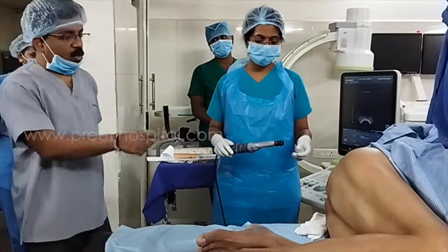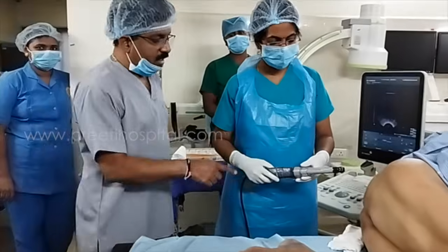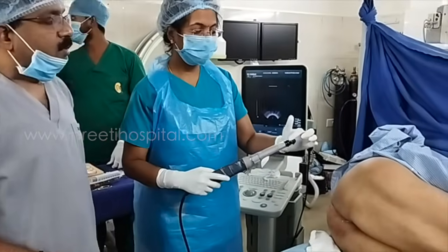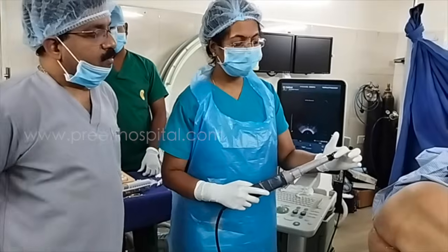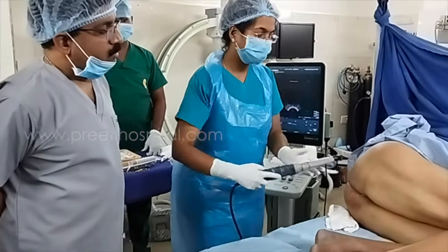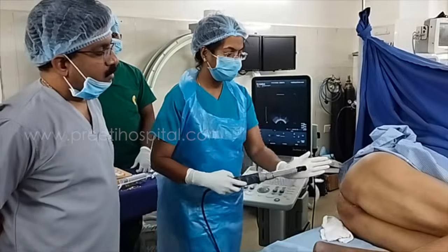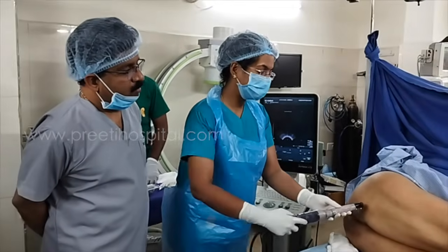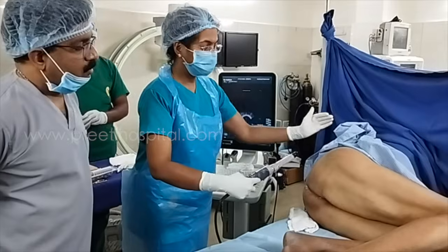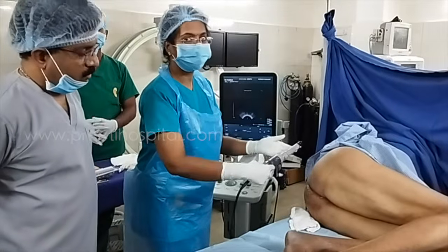Okay. So now you insert. While insertion, what is the probe position? While insertion, the transverse and sagittal parts will be seen through this. The concave part of the probe will go along the angle of the rectum and anus. We insert like this and then turn towards the lumen of the rectum. Until we see the seminal vesicles, we have to introduce the probe.